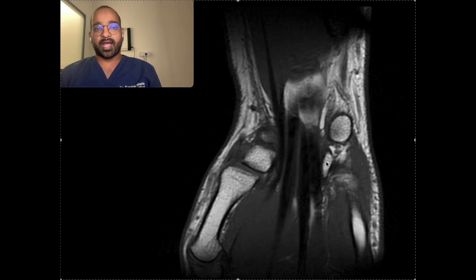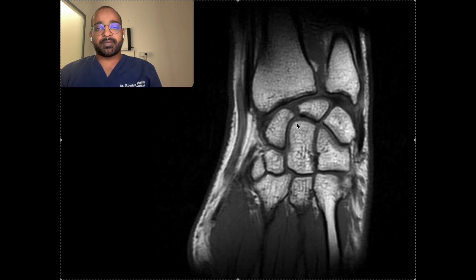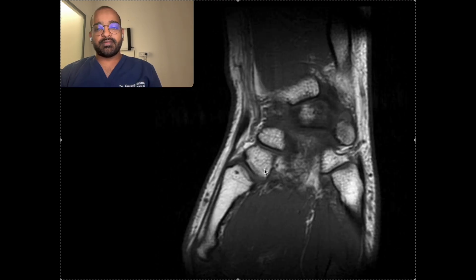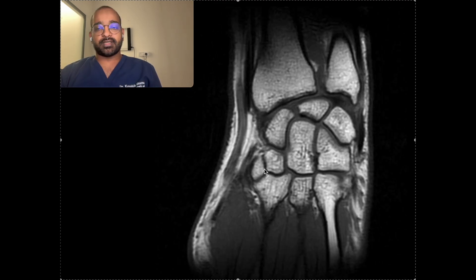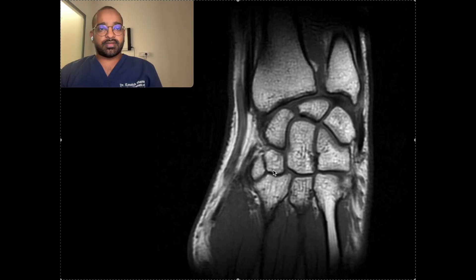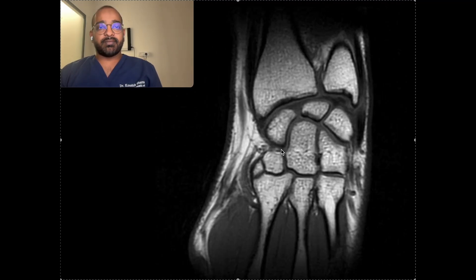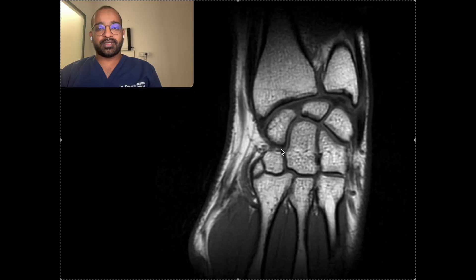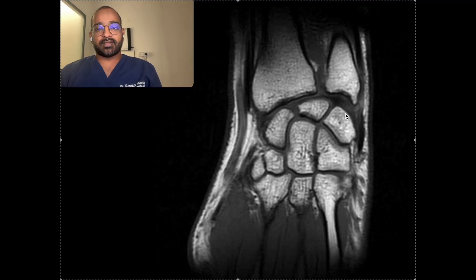These carpal bones form joints with the metacarpals — these are the carpometacarpal joints. On T1 we can better appreciate the anatomy, which is why I have put this T1 section — bones are better seen. This is the ulnar styloid process here.